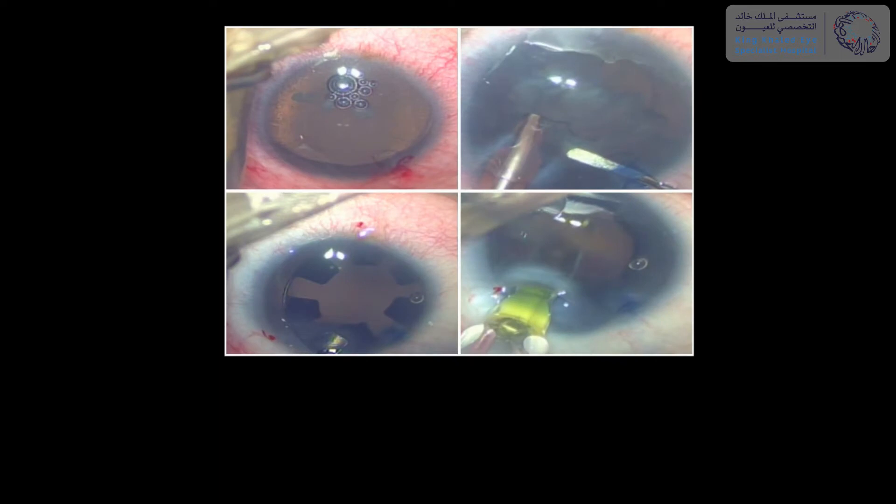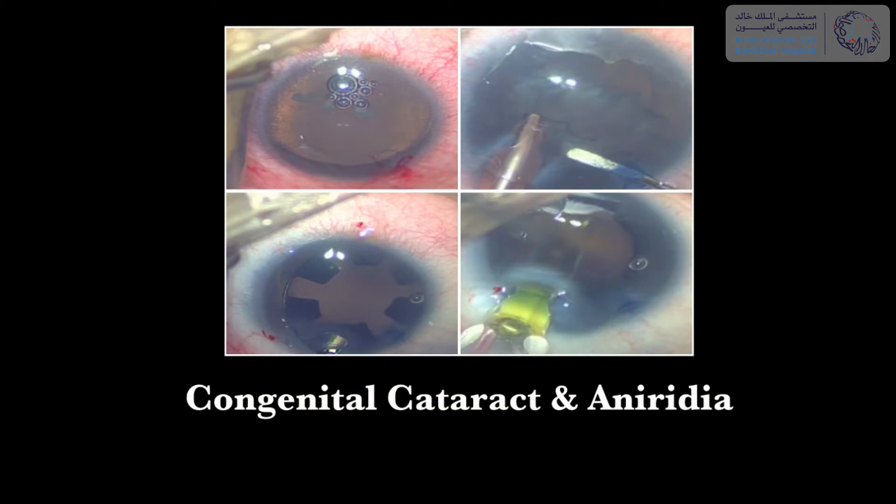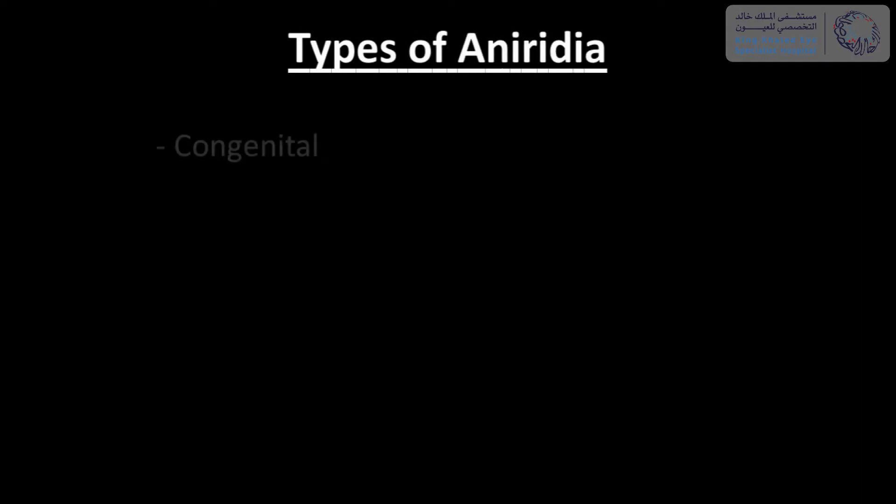Hello everyone. In this video we'll share with you a technique of lens aspiration and implantation of double aniridia ring segments in a case of congenital cataract in aniridia. Aniridia rings come in different designs and can be used for various types of aniridia such as congenital, traumatic, and surgical.